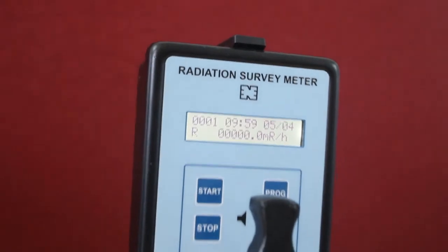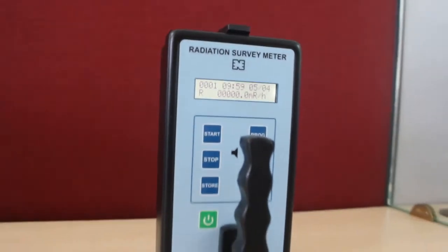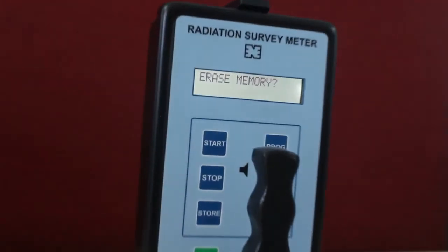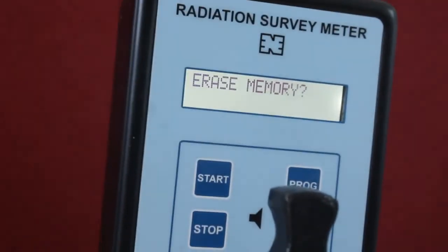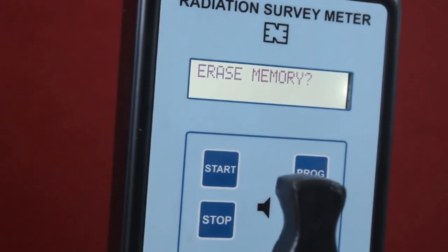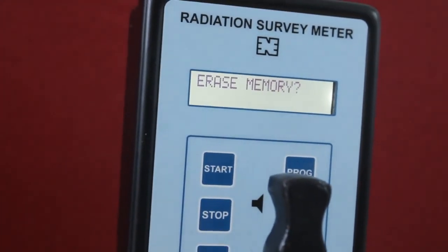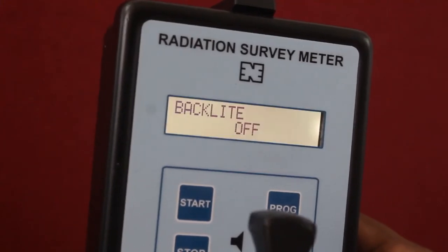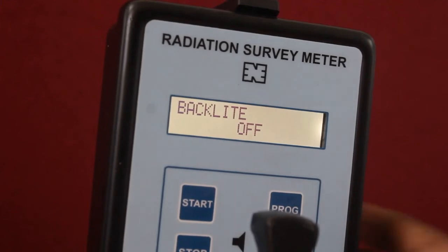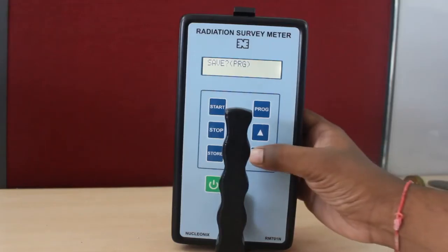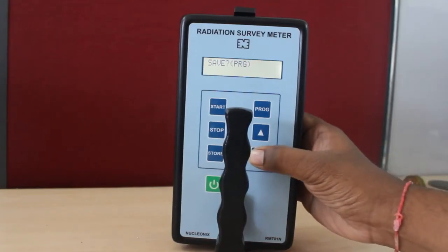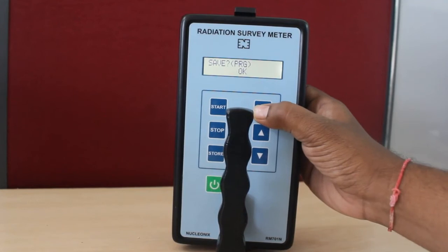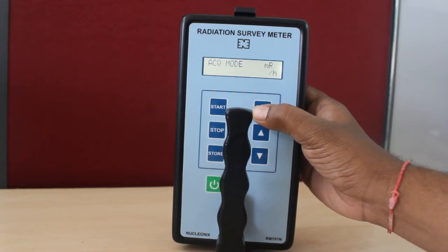The recalled data shows time, date, label, and the readings stored. Erase memory is used to erase the readings or memory stored in the machine. Backlight is used to turn on or turn off the display light. Save prog is used to save the changes that you have made per your requirement.